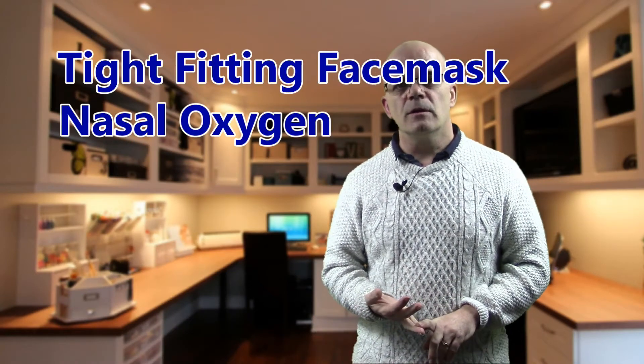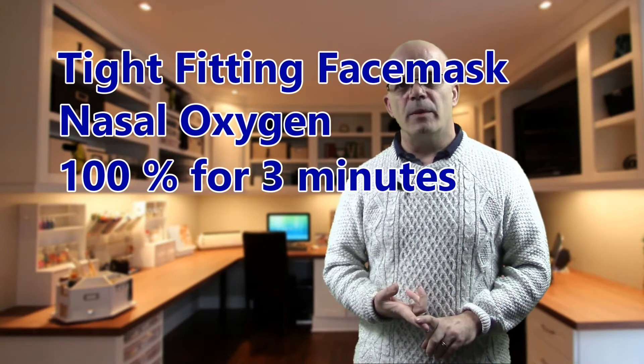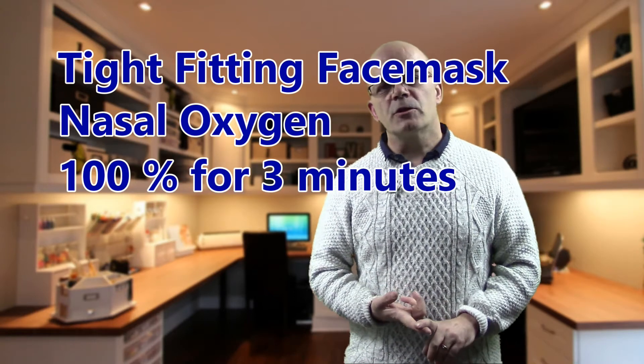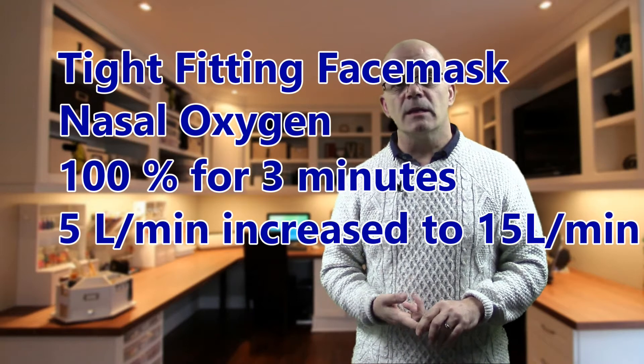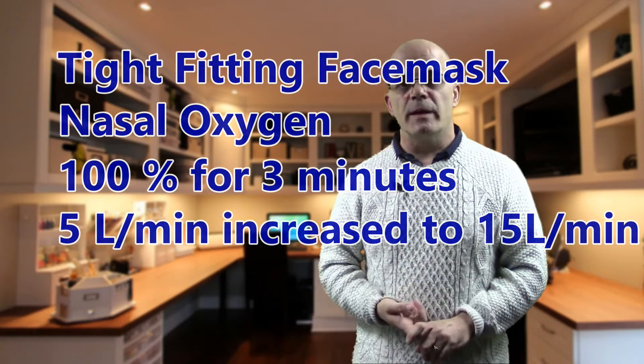So the recommendations at this point are a nice tight-fitting face mask with nasal oxygen, a hundred percent for three minute washout period where the nasal oxygen is going to run at five litres a minute and this will then be increased once the patient is asleep.